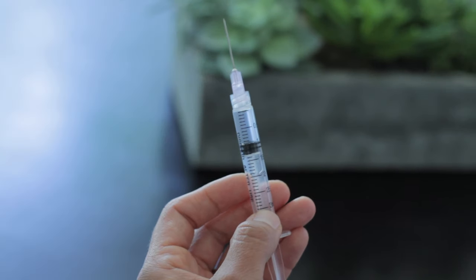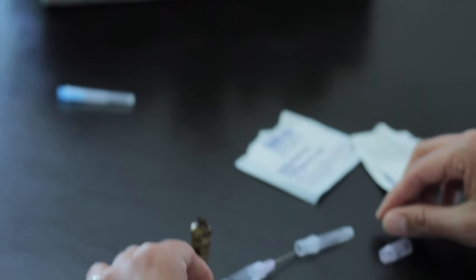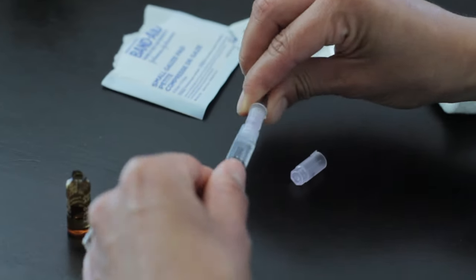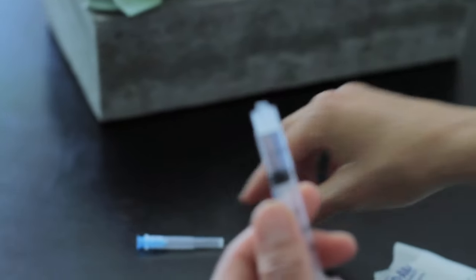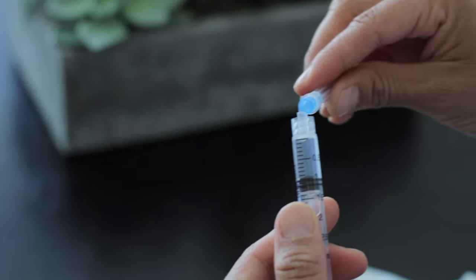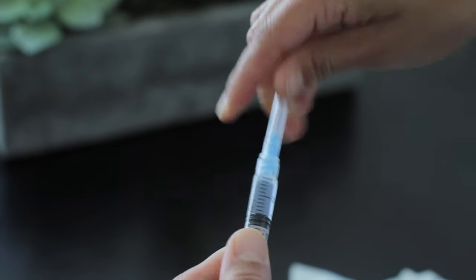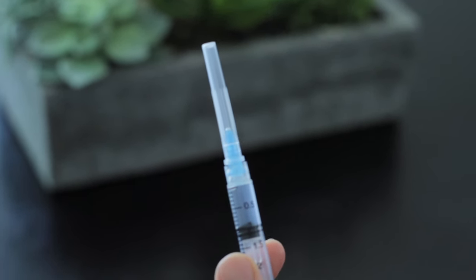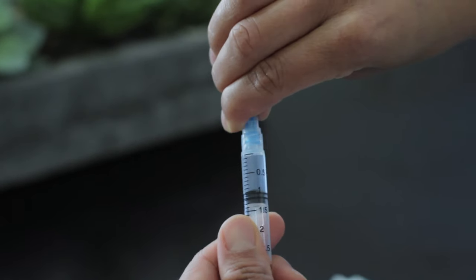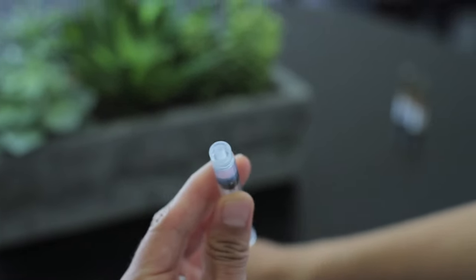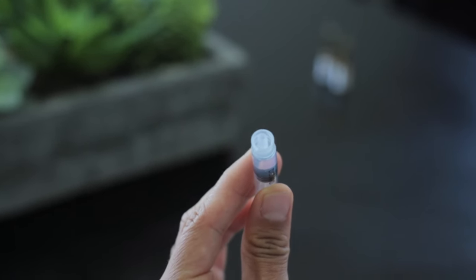And there we go, we got one mil of medication. Now I'm going to recap that and dispose of that in the sharps container. And then I'm going to attach a needle I'm going to give IM, depending on the route. Or if I'm going to give it through the IV, I'm going to detach the needle and then I can attach that to the IV. And we're ready to go.